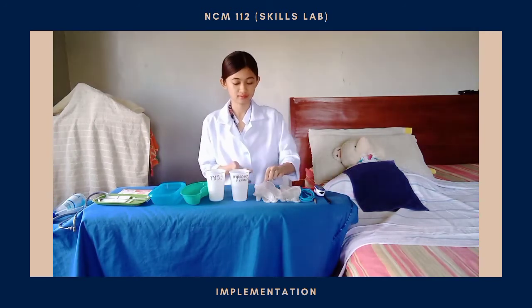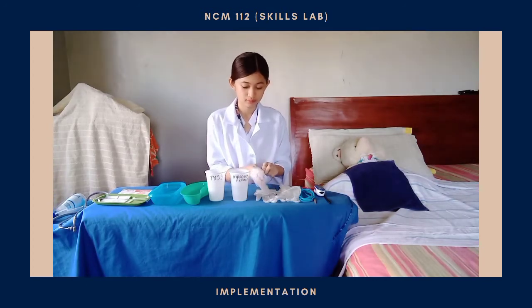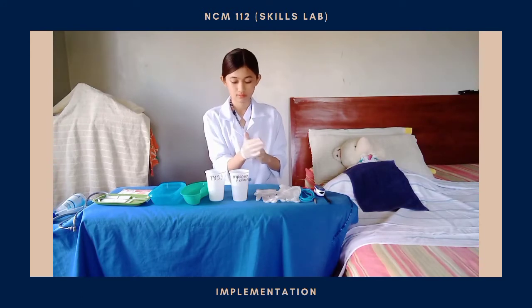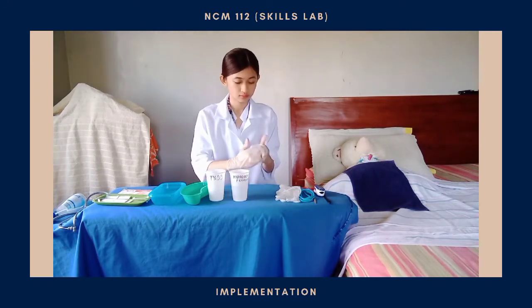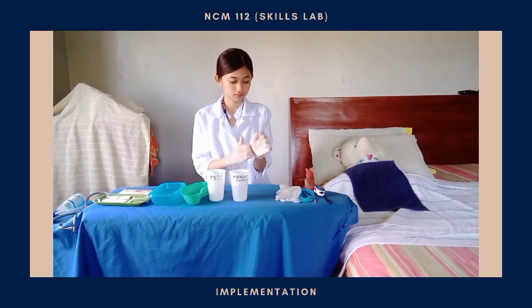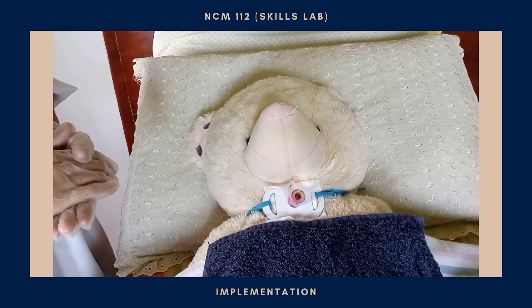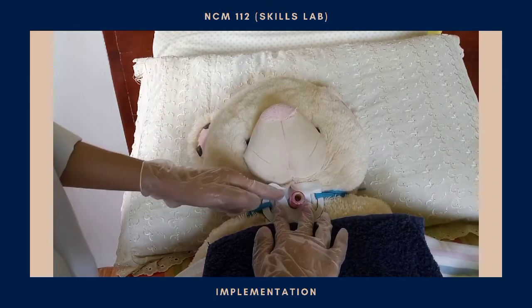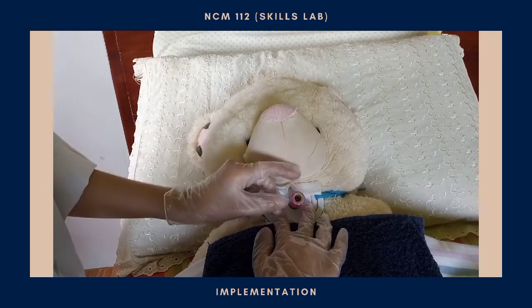Then perform gloving. Remove the oxygen source if one is present. Stabilize the outer cannula and the faceplate of the tracheostomy with your non-dominant hand. Grasp the locking mechanism of the inner cannula with your dominant hand, then press the tops and release the lock. Gently remove the inner cannula.